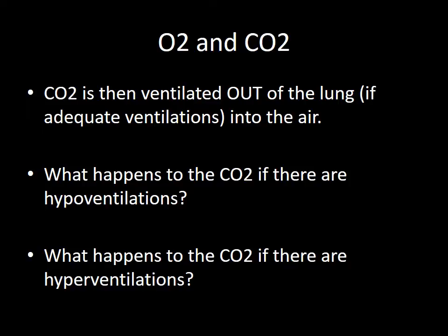And that's almost counterintuitive to what you think about. You think, oh, if I'm breathing really fast, the machine is going to measure a whole lot of carbon dioxide because I'm breathing a lot of carbon dioxide into that machine. But it's actually measuring the carbon dioxide within your body, which has just left your body. So it's a measure of the inside of your body, not how much you're blowing out. So it's counterintuitive. Sometimes the first time you look at capnography, it's almost backwards.